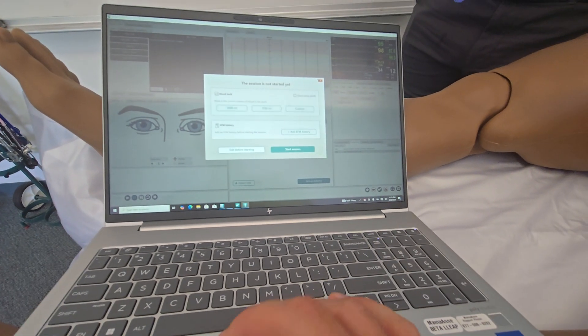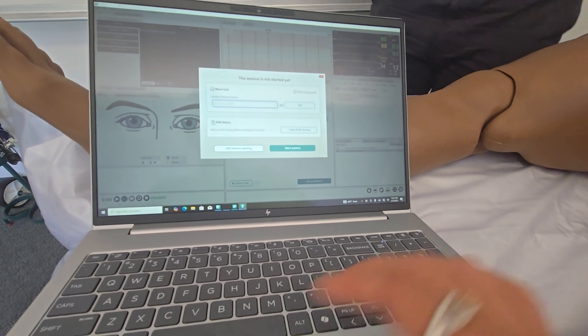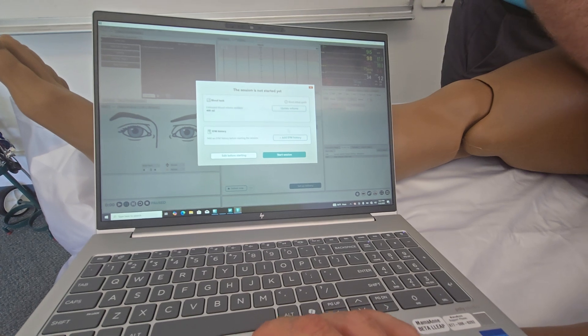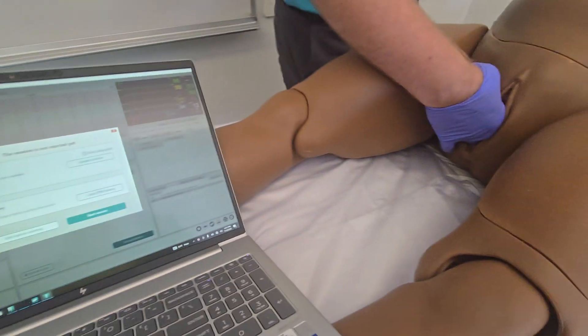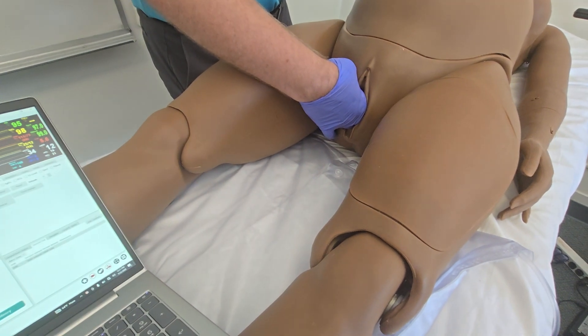Because it's usually used with the external blood reservoir the two presets are pretty high, so we're going to hit custom and then enter 400 milliliters. You can also add EFM history if you'd like, but we're going to go ahead and just jump to start session. And now we're in.